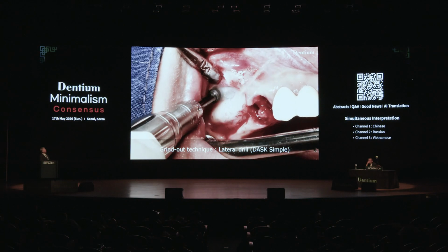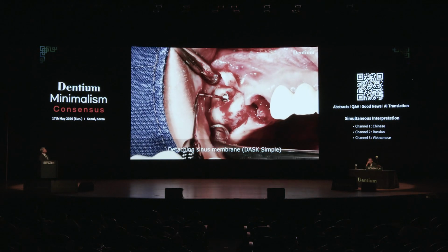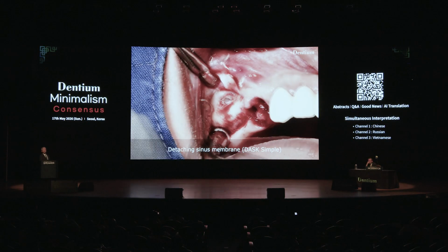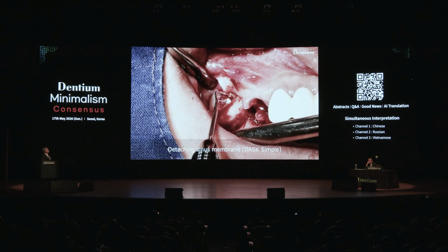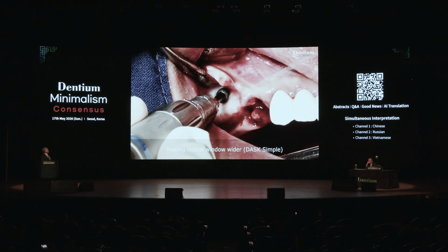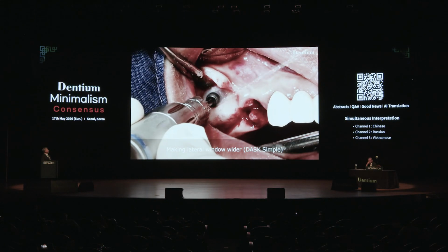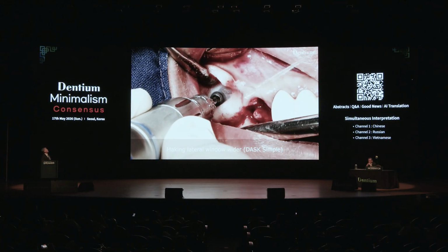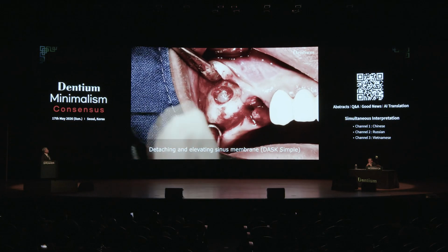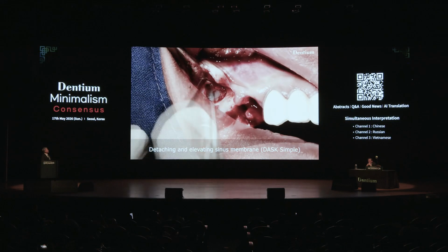If the membrane is exposed, we try a perpendicular approach to prevent grinding through the sinus membrane. So initial detachment is very important, with a small round bur after the initial detachment. After that, a little bit of widening, to prevent grinding through the membrane. But sometimes, if you grind through the membrane, that can be a cause of membrane perforation. So step by step, sinus detachment from the small instrument to the longer implant.